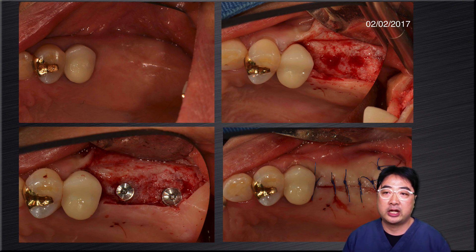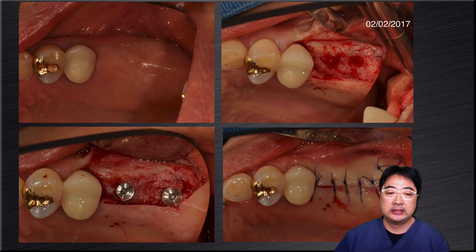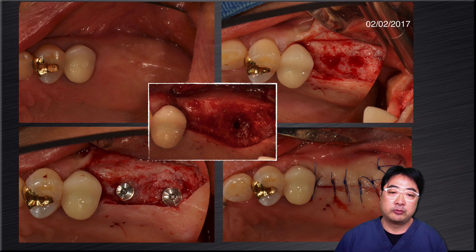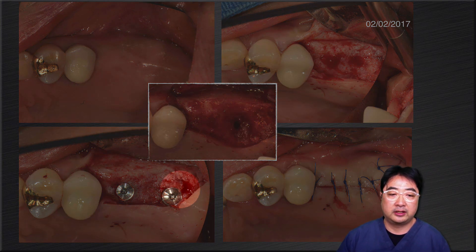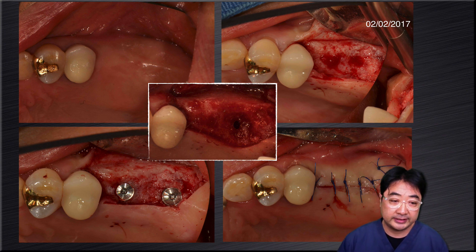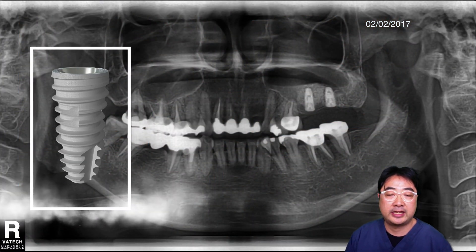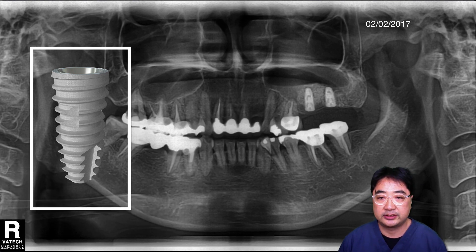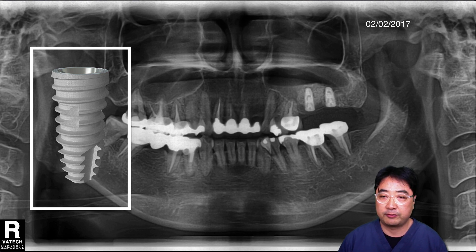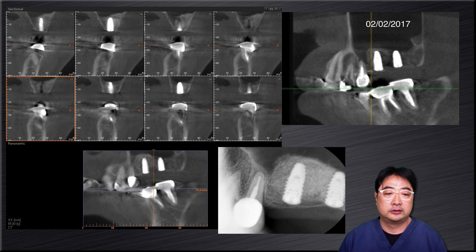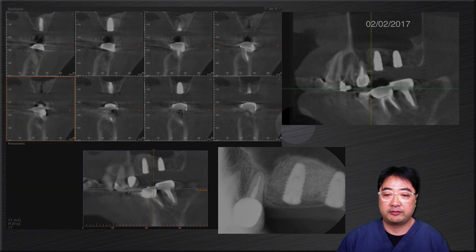Six months later, I opened it up and re-entered for implant placement. This is how I placed implants on number 26 and number 27. That area corresponds to where the perforation was before. From the panoramic view, I placed the IA3 Active, which is a little different from the IA2 Active — I'll have another clip to explain the difference. The implant sizes are 4.5×10 and 4.5×8.5.